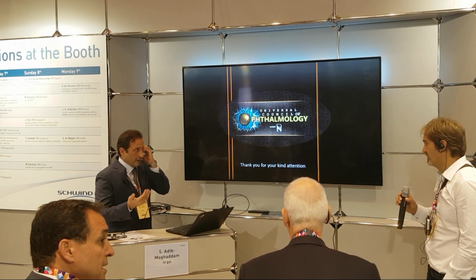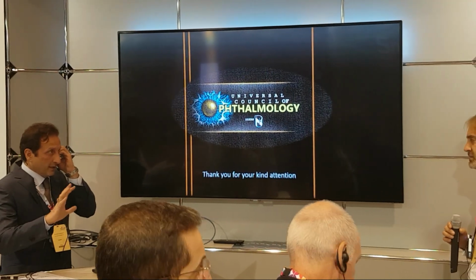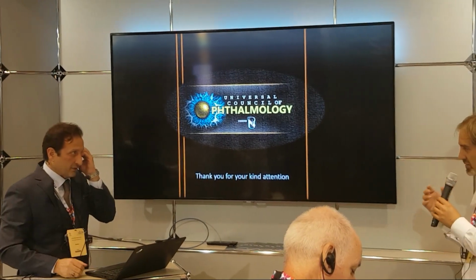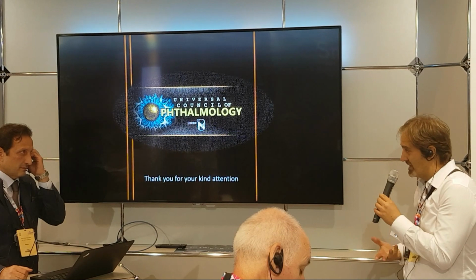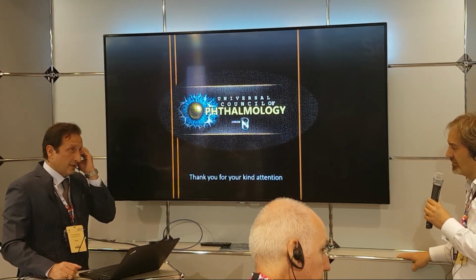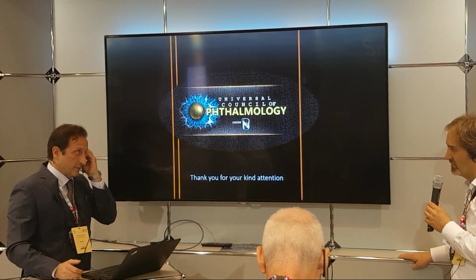But the main factors that we made changes on were target refraction and choosing the amount of these changes based on different things like gender and age. It's our own nomogram on the regular machine. Are we talking about the machine itself today for our Amaris users? We send all our database information to the company, and you have to ask Samuel whether they have used some part of our data for new software, I don't know.